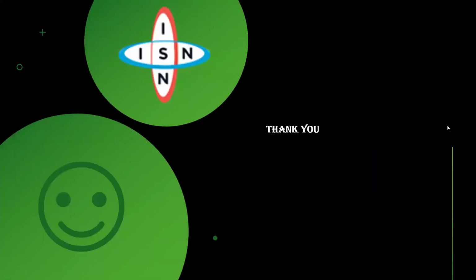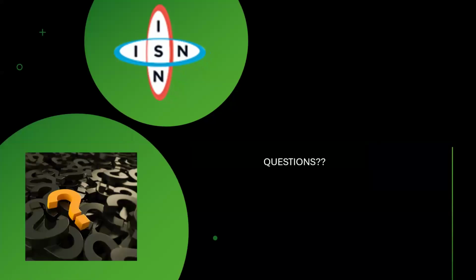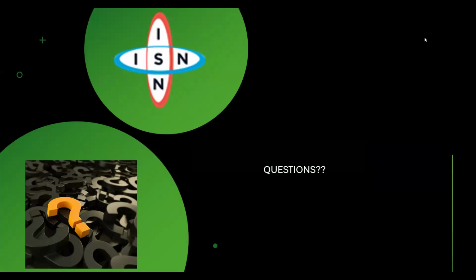Like I said, this is a very short meeting. So now this is the time for questions. Please, do you have any questions concerning calibration, quality control, and validation on your Beckman analyzer? Any question?